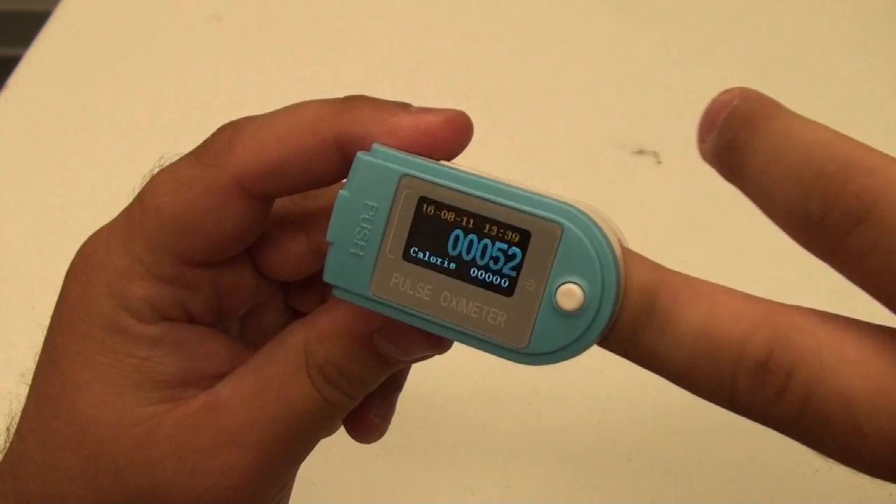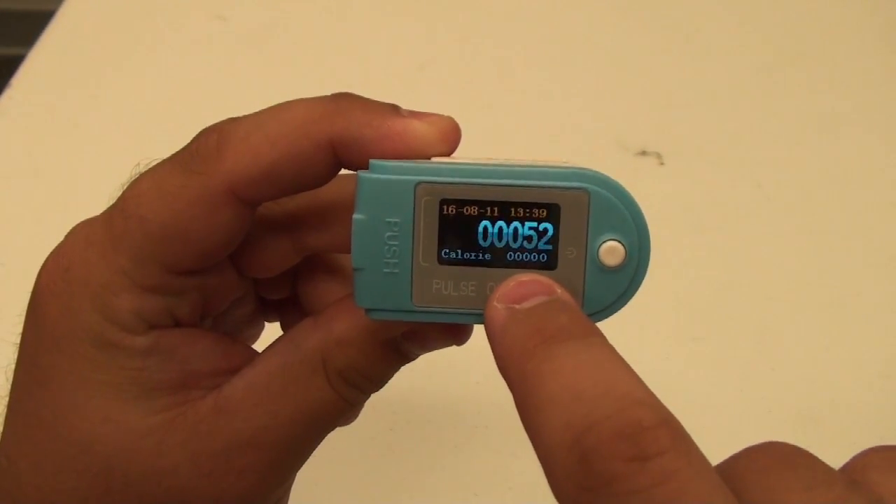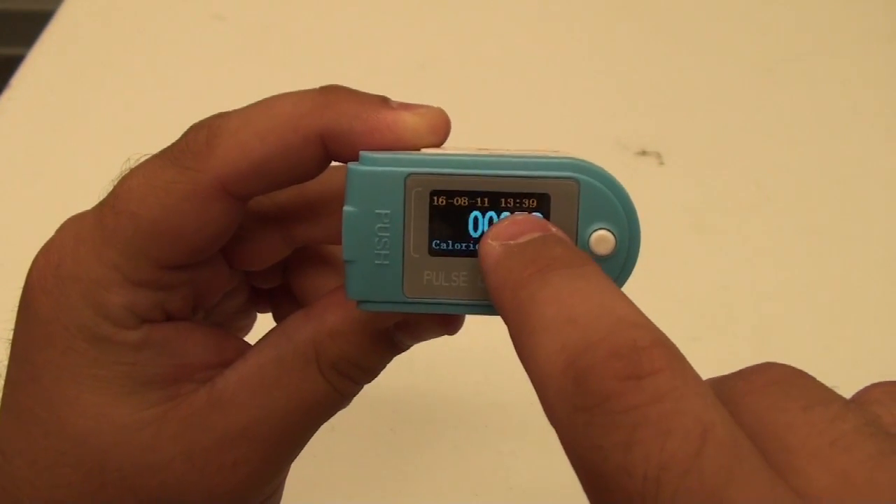If you take your finger out of the device, you will notice that it will start counting your steps and has the capability of counting calories. It also shows the date and the time.